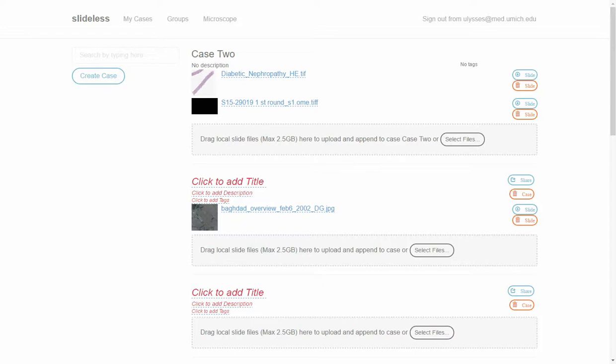in the demarcation of ground truth maps, so-called segmentation of histology, which is otherwise an extremely lengthy, time-consuming, laborious process, which has the general property of slowing down the pace of discovery by virtue of the immense investment in time that's required on the part of subject matter experts to generate ground truth maps for image analytic development.